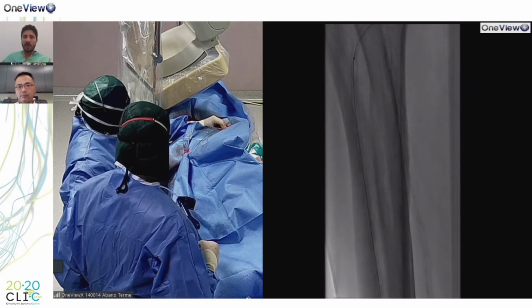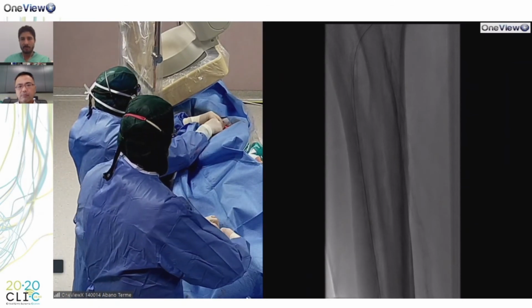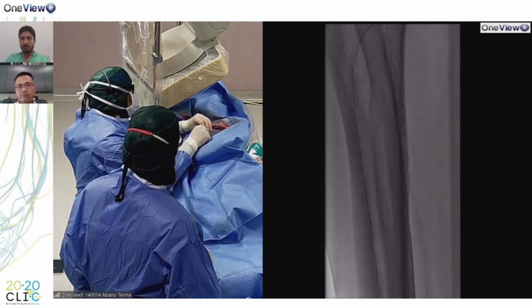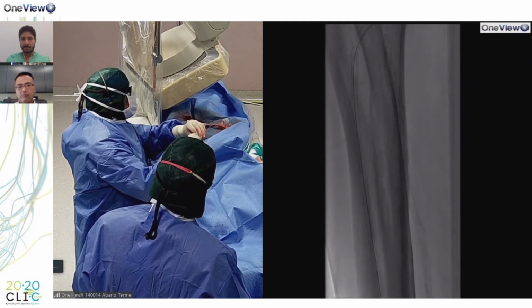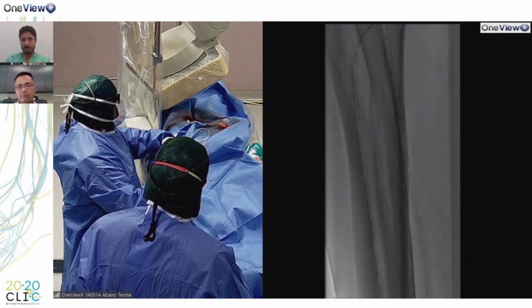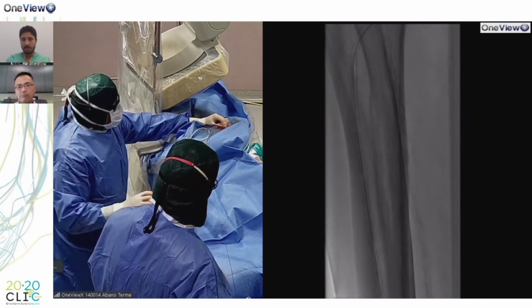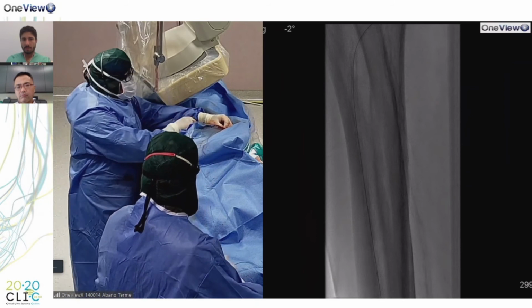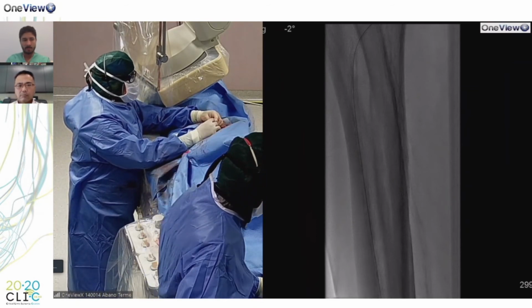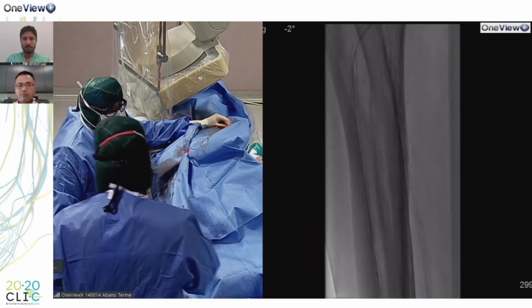So it was a pre-dilatation very fast. That's correct? Just a pre-dilatation. Yes, it's not a definitive dilatation. So we just want to crack a little bit and let the atherectomy device arrive down. I would like to show you the acute aspect with CO2.